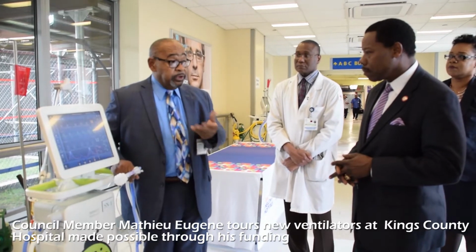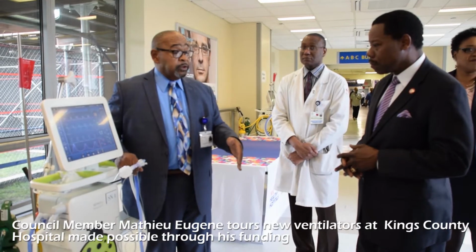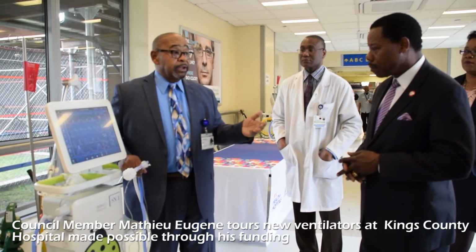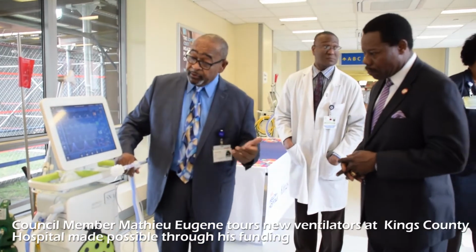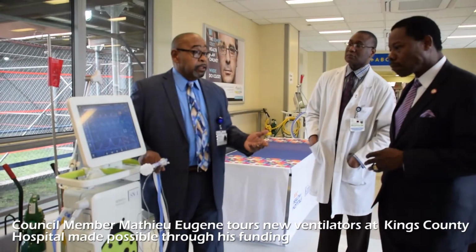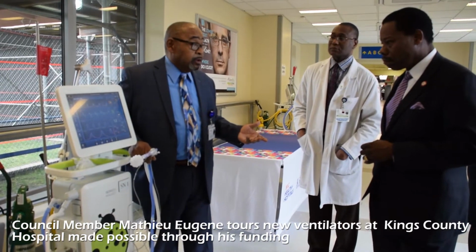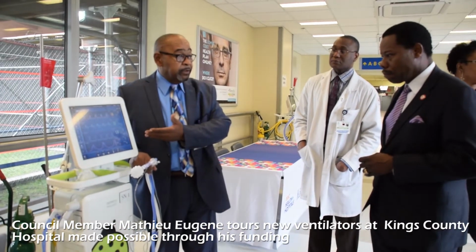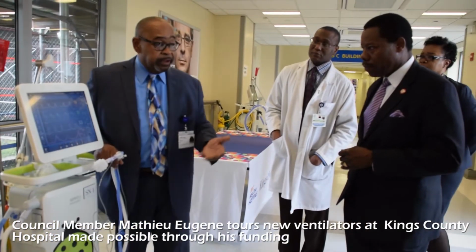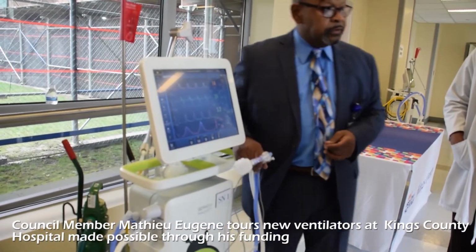All right, and also that we use the electrical activity of the baby's diaphragm to turn the breath off. So baby controls the start of the breath, size of the breath, and the end of the breath. And the whole idea behind that, again, is so that, you see this up here? That represents a wasted effort, meaning that the baby wanted a breath, ventilator didn't see that, so it didn't deliver. But that's when you're burning those kilocalories, right? So this simulator shows that. And this is, again, what we use for physicians like yourself to show them how this technology works.